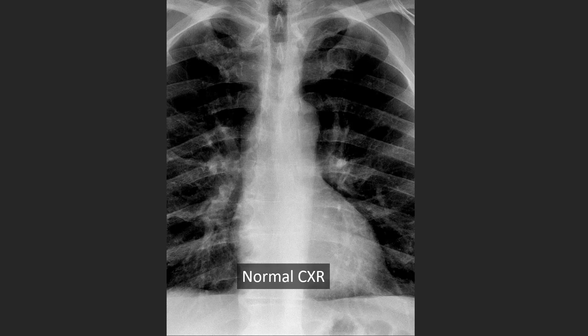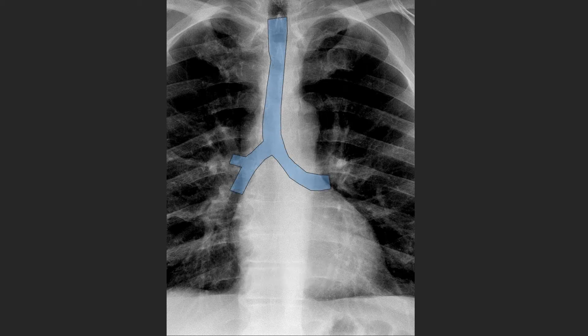Here's a normal frontal chest X-ray that we're going to use as our standard. The trachea extends from the thoracic inlet into the chest cavity and then divides at the level of the carina into the right main stem airway, which is very short and vertically oriented, and the left main stem airway, which is more horizontal and has a longer course.